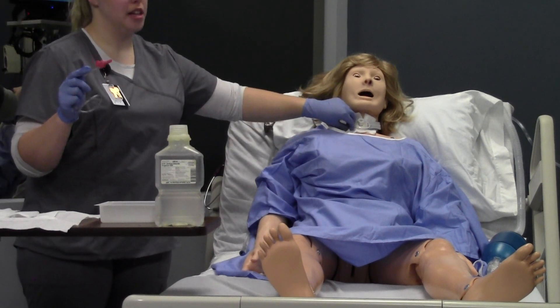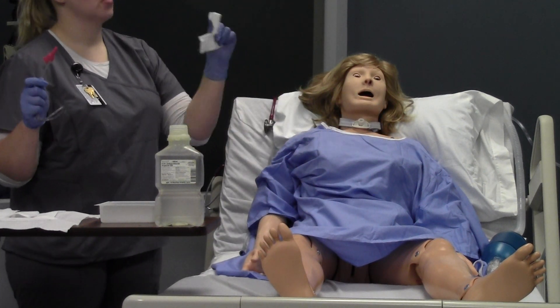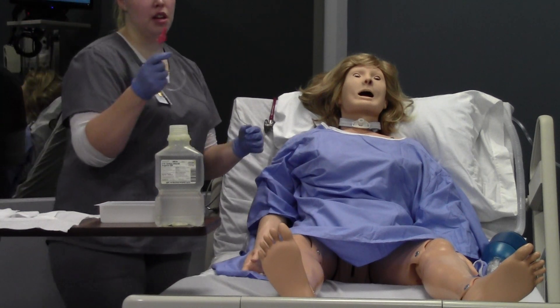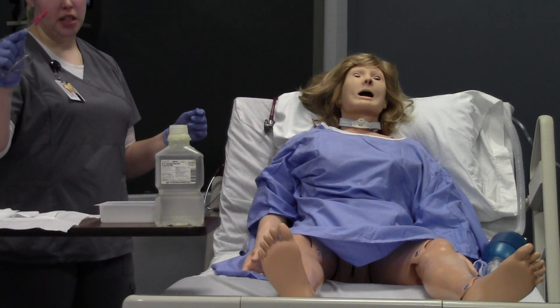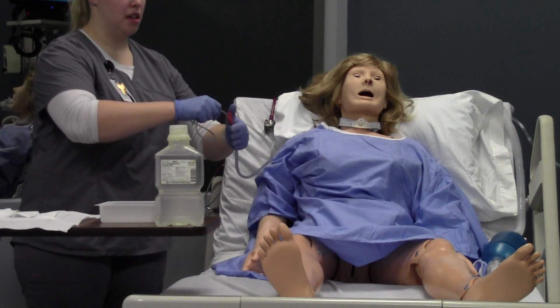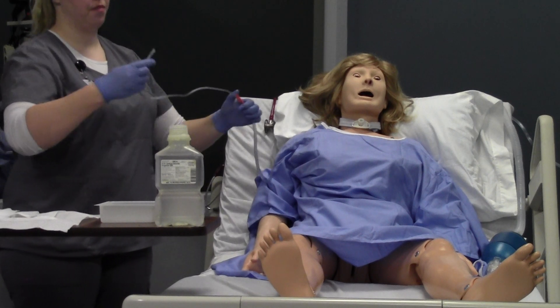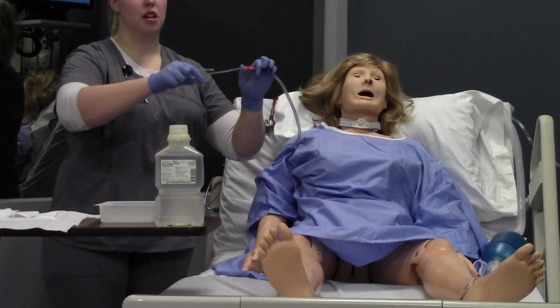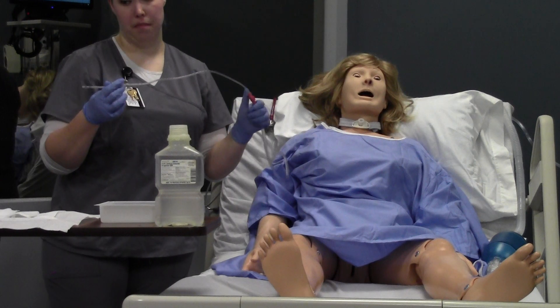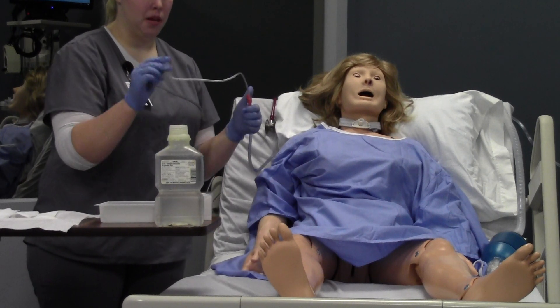I don't like to have my patient's dirty dressing underneath while I'm doing everything clean, so I'm going to go ahead and remove that now. I'm going to assess the amount of drainage, the color, and if it smells, then throw it in a biohazard container. This red end is what I will connect to my suction. I can use my non-sterile hand to connect it together and make sure it's connected correctly. The red part is no longer sterile — that's what I'll use to control suction with my thumb. I'm going to lubricate my catheter in the little cup and suck some saline up.